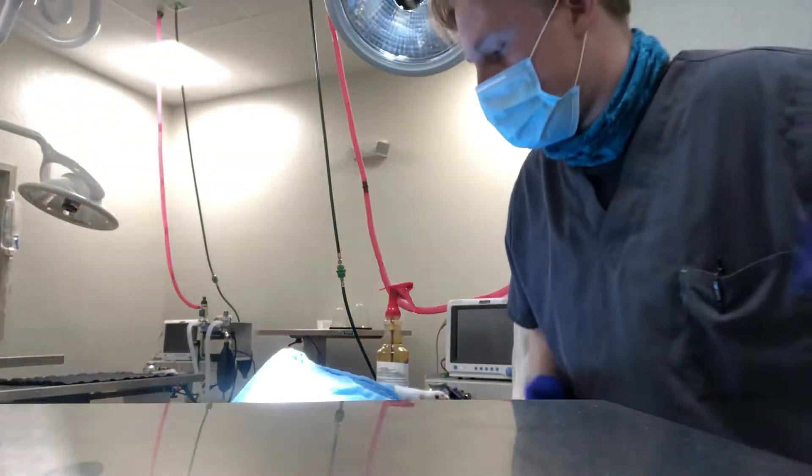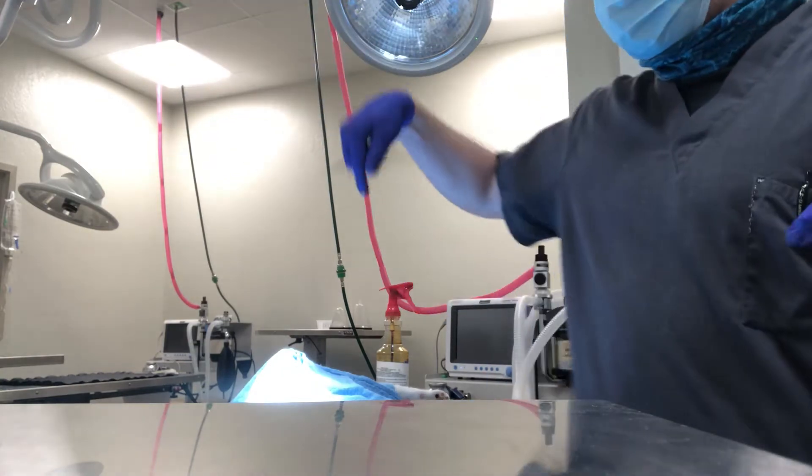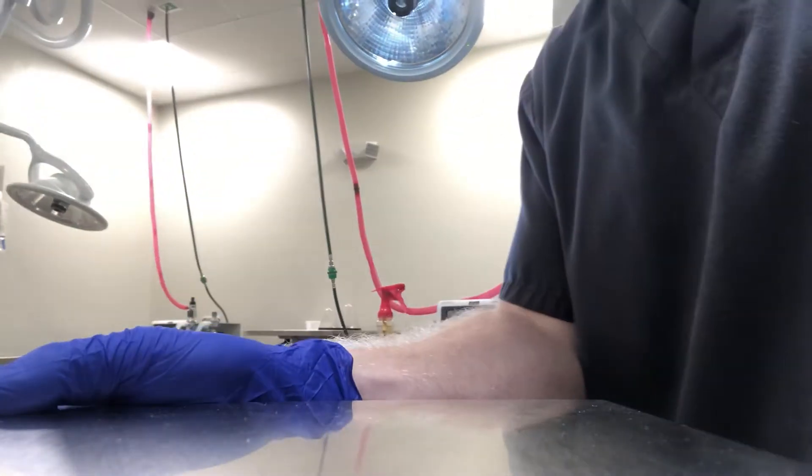We're continuing on with our cat neuter video. I have Dr. Gillespie right here, we have all of our instruments here, and our cat is actually suspended right here.